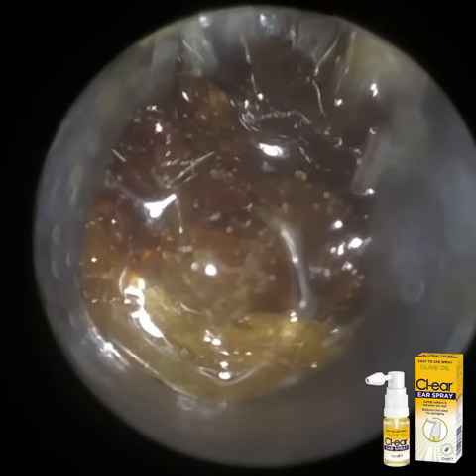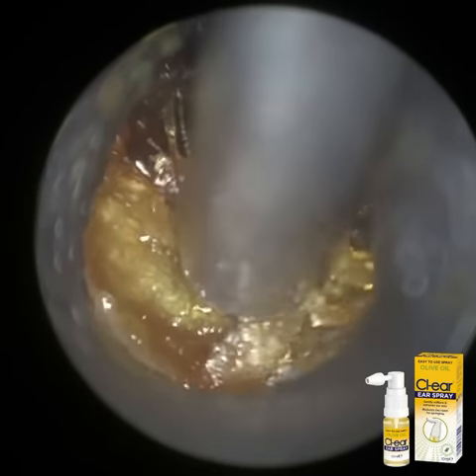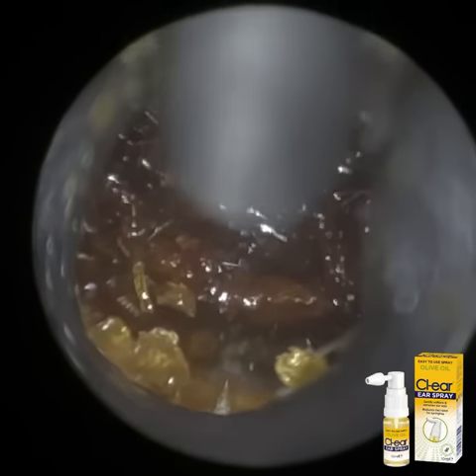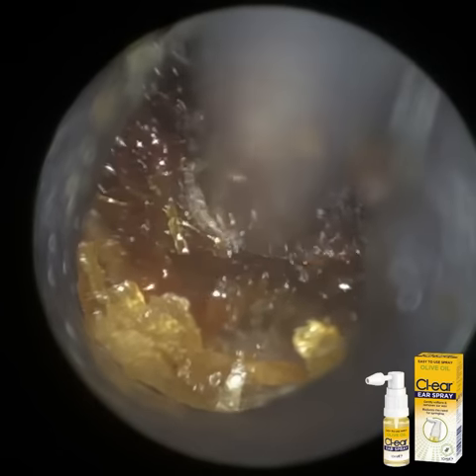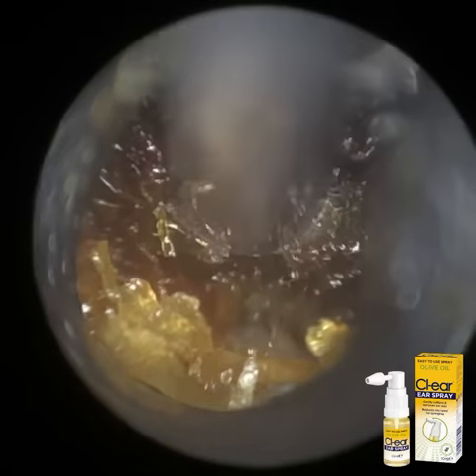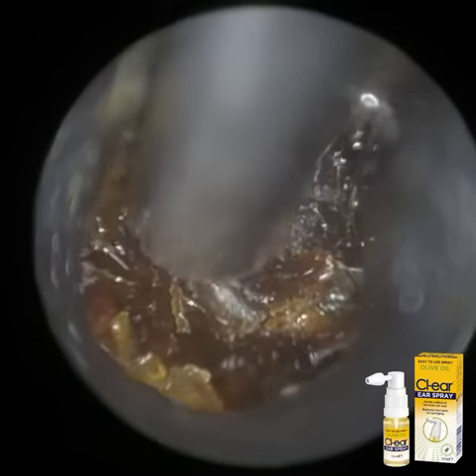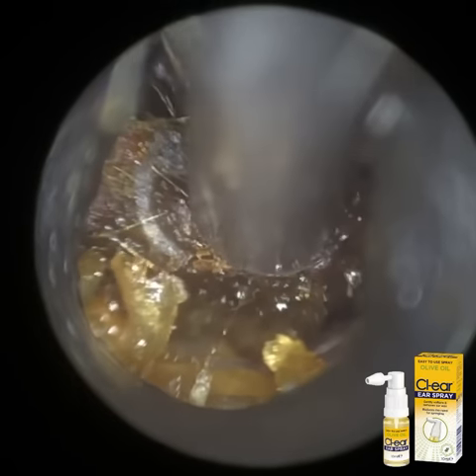So you can see I've just instilled Clear olive oil ear spray into the ear, and it's just changed the consistency. It did make quite a lot of difference, actually. Now, at the base of the ear canal, we've got this really thickened layer of skin, keratin. You may be able to see that. So what I'm suctioning at the moment is earwax, and just below that, at about 7 o'clock, you'll see some more lighter shade of debris, and that's dead keratin.